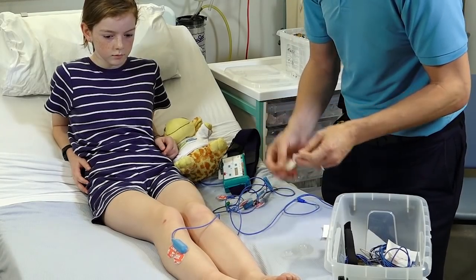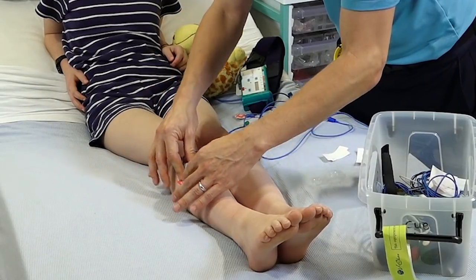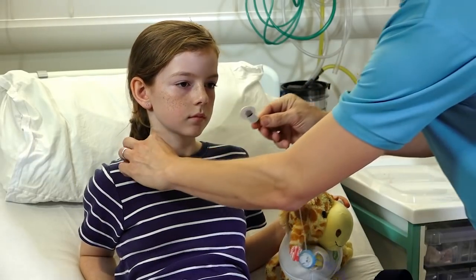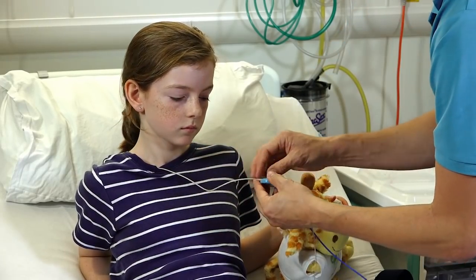We don't want this to fall off so I'm going to put a wee bit of sticky tape over the top. Is there anything you'd want to ask about the test? Does it hurt? It doesn't hurt — because if we put stuff on that would hurt, do you think any of the boys and girls would sleep? No. So actually all the things we do just sit there and watch. It just feels a bit funny because it's not what you normally do when you're in bed.